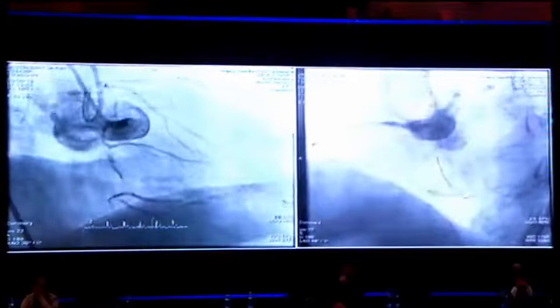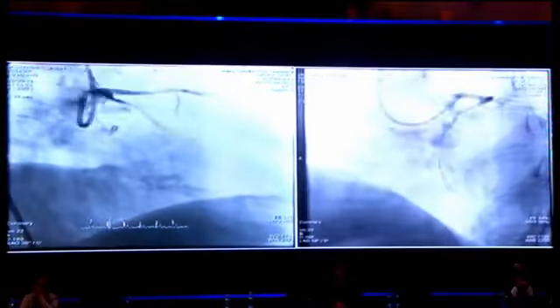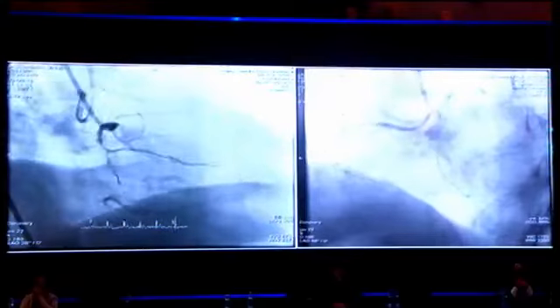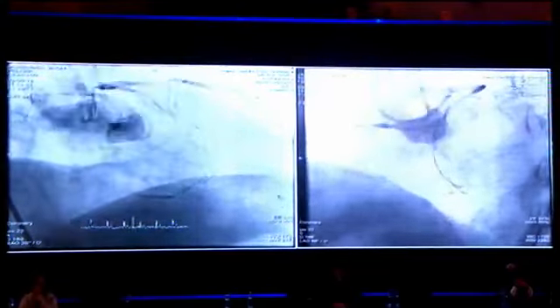Yeah, it looks reasonable to try the antegrade first, because it's a very long segment. That we understood. Even though multiple lesions are there, still there is up to the mid segment of the RCA, so it looks fair enough to go for the antegrade.